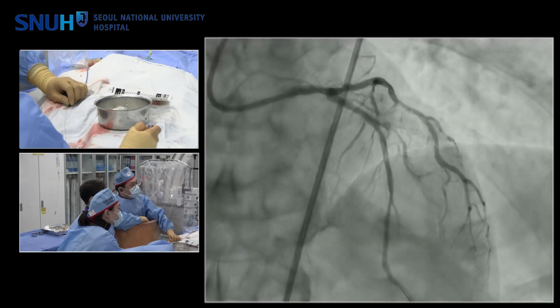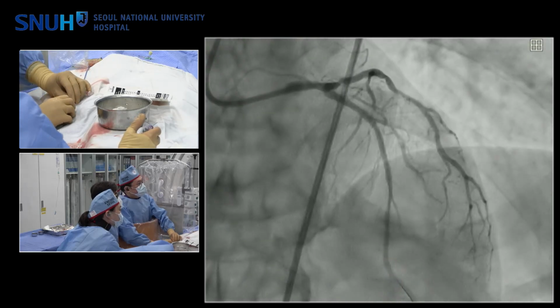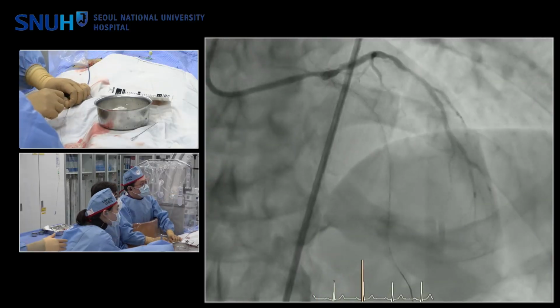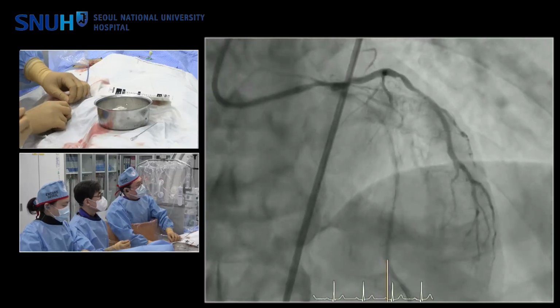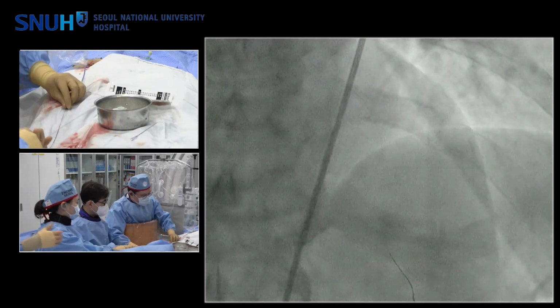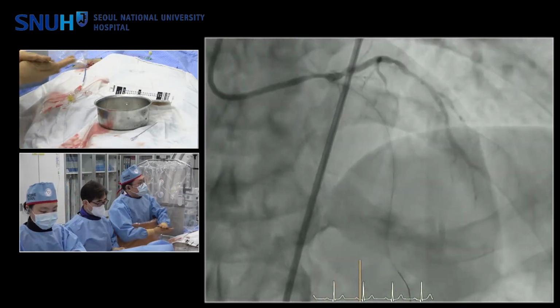So when you have that discrepancy, generally we tend to oversize and use low pressure to make sure we have apposition at the proximal vessel. The size is related to lumen diameter, not the vessel size. But in the left main, consider the left main, it's better to use 3.5. Better to oversize the IVL balloon.